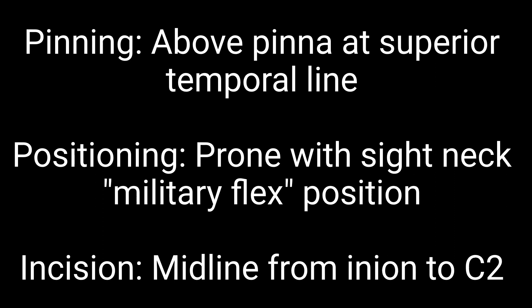The patient was pinned at the superior temporal line above the pinna bilaterally. She was placed in prone position and her head was secured in a slight military flex position in order to facilitate exposure and screw placement.